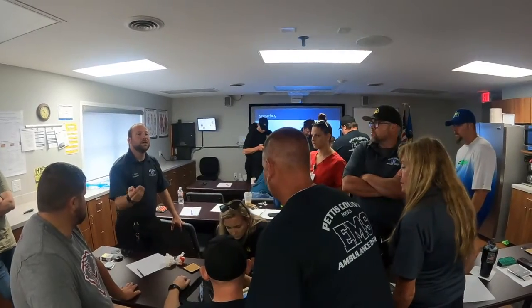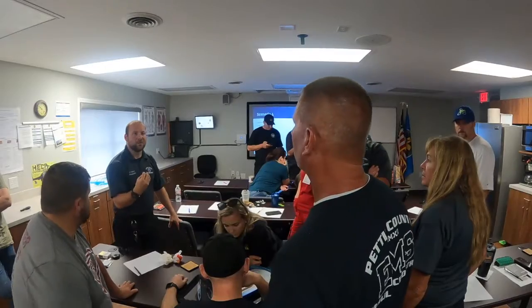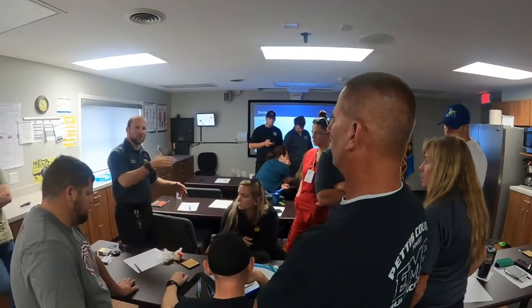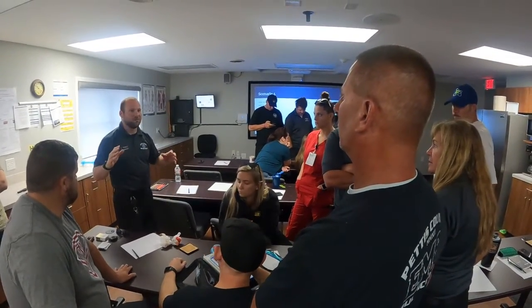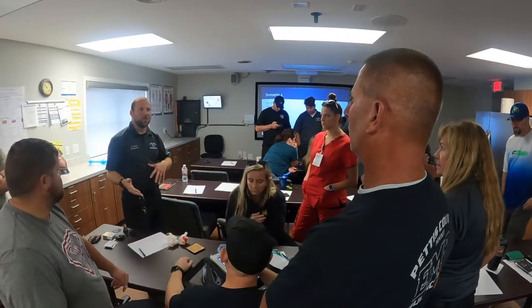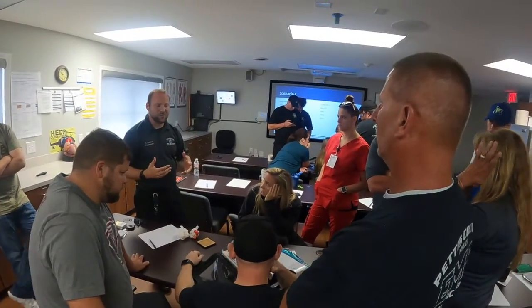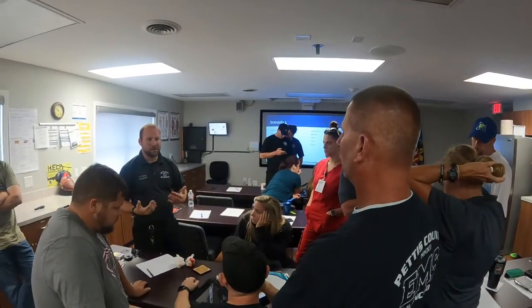But trigger mode is how well this vent is going to correlate with my patient as far as triggering a breath for them. If we go in the positive direction, like -1, 0, 1, or 2, the patient could just hiccup and it will go nuts, because it wants to take a breath. Generally, let's start at -2. If you need less, go to -1. If you need more, go up to -3. You don't really have to go higher than -2, but -1 if someone really does not have the drive to initiate the vent like it needs to.